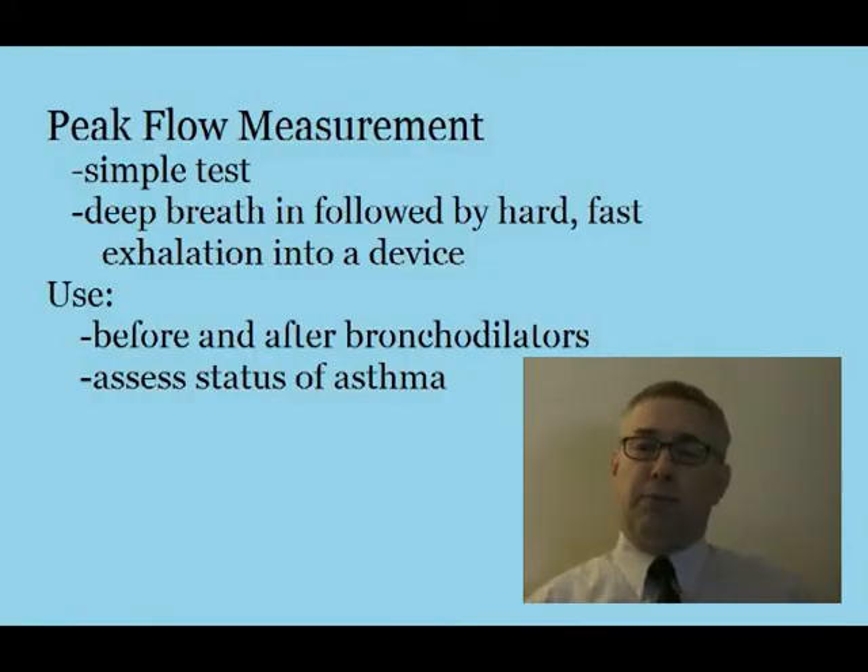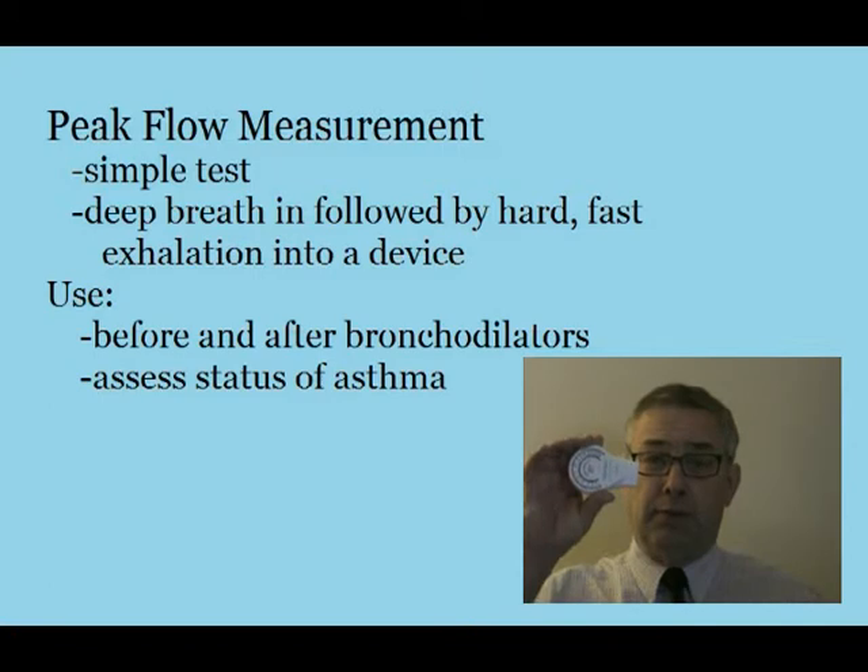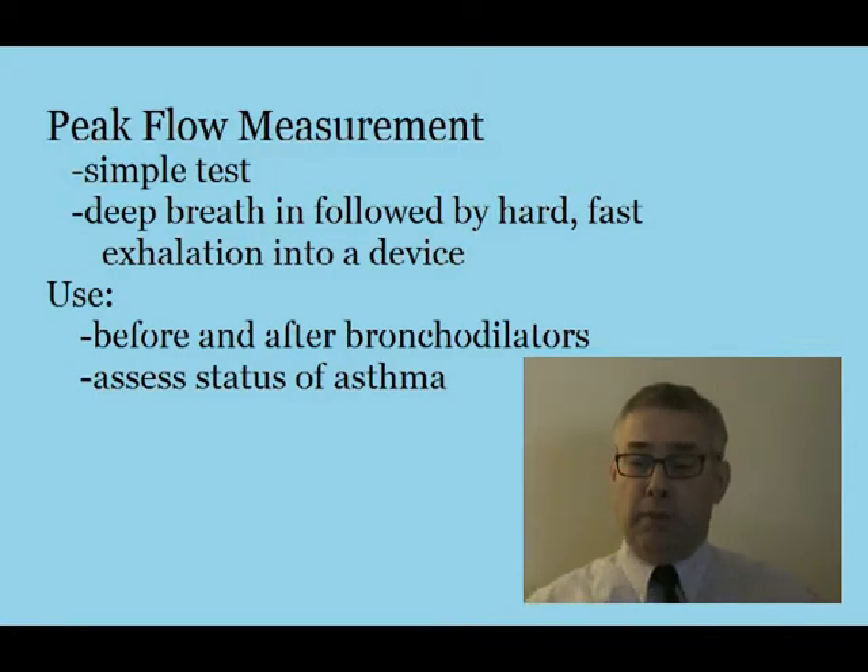Peak flow measurement is a very simple test. Basically, all you're going to have the patient do is take in a deep breath in, followed by a hard, fast exhalation into the peak flow meter. Remember, this is used before and after bronchodilators to check to see if there's a difference in measurement, as well as assessing the status of an asthmatic patient.